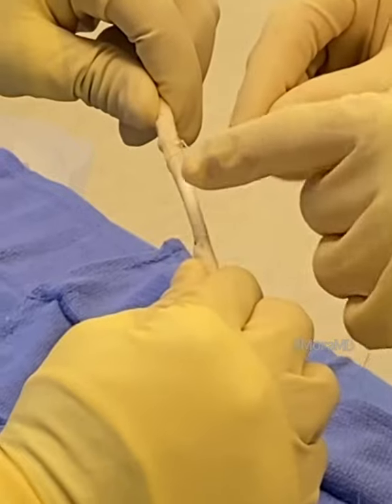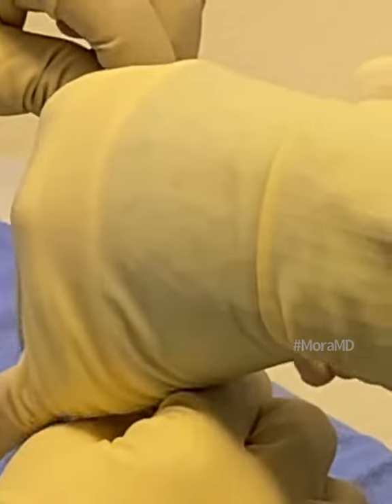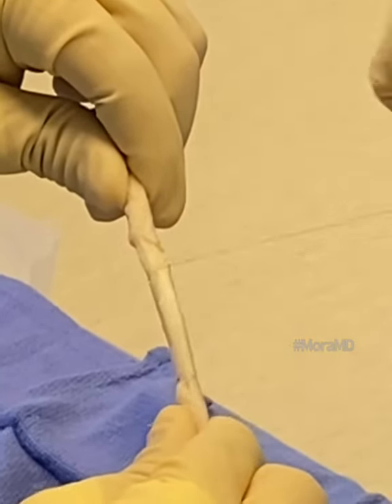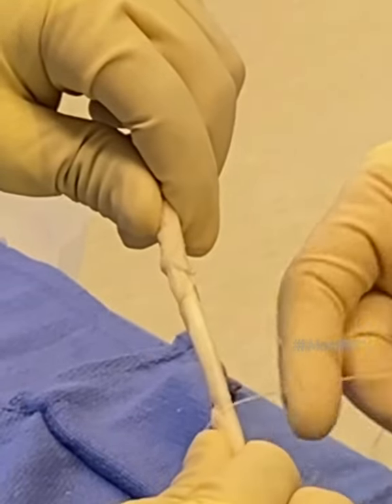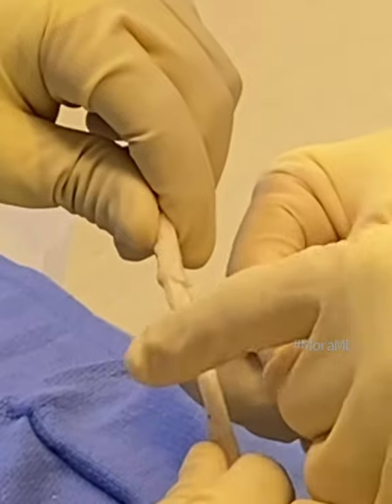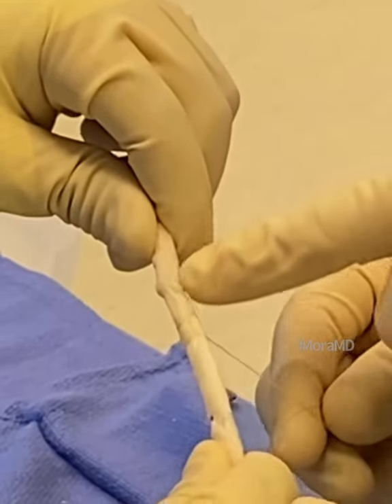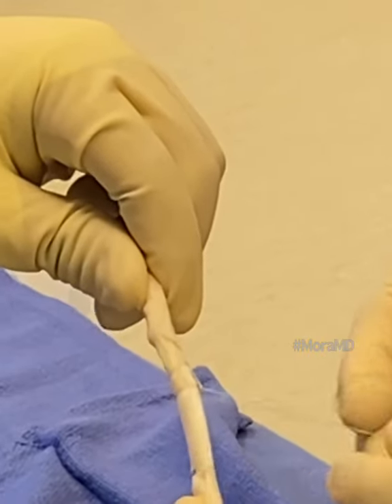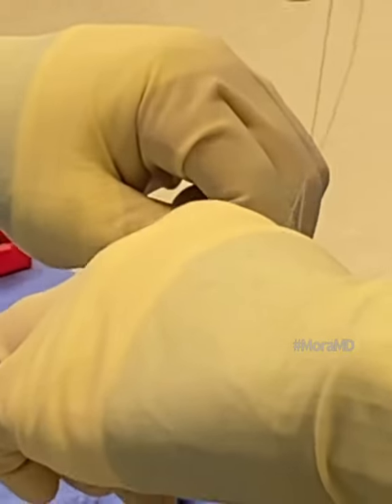I'm going to zoom in on that so you can see — I bring a loop around the top, bring my suture through the center of that loop, and then put that half hitch in. I do this over and over all along the graft, then tie it off at the end. This is graft preparation for ACL reconstruction using an allograft.